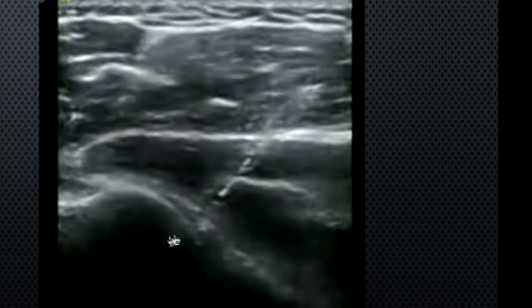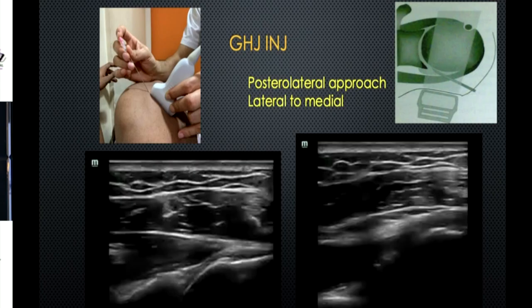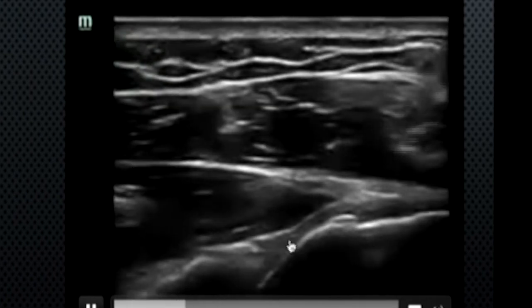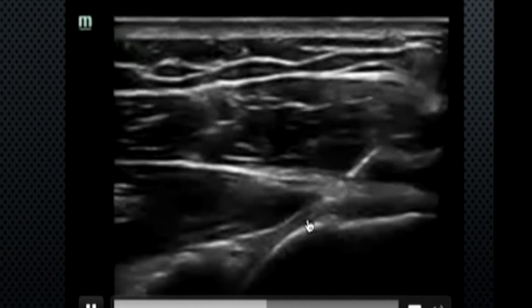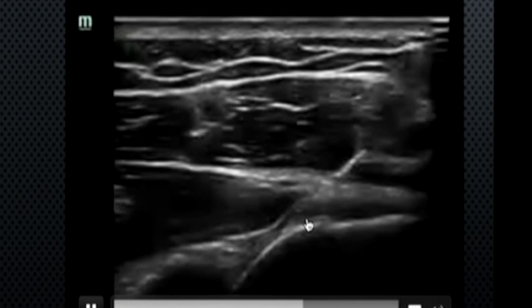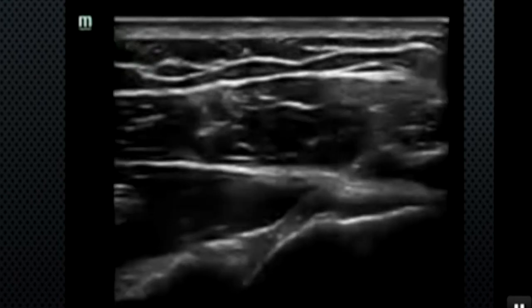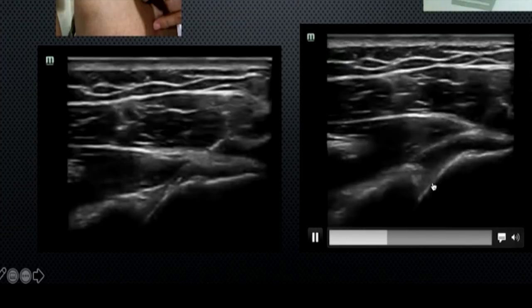Hit the humeral head, then inject a little to see whether you are in the joint, then inject the whole dose. Before injecting the full dose, use that small 1 ml of local anesthesia and inject into the joint to confirm placement. For the lateral approach, use an 18-gauge spinal needle because you traverse a longer tissue. Give a little local anesthesia, then take the needle into the posterior superior glenohumeral recess — traversing the deltoid and infraspinatus. Ensure the needle tip is within the glenohumeral recess, not within the labrum, to avoid labral injury.